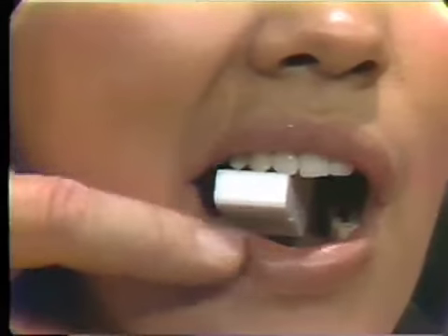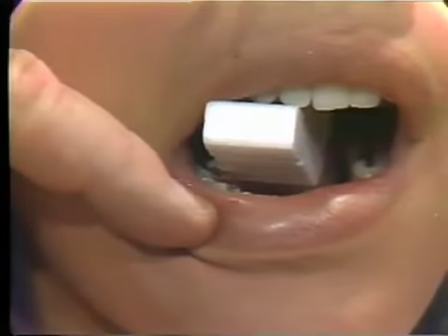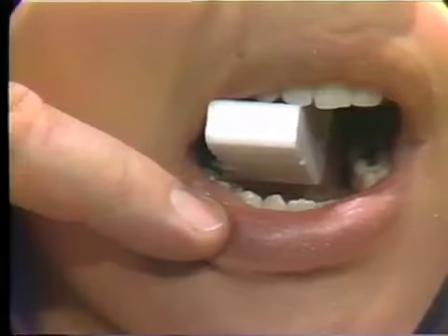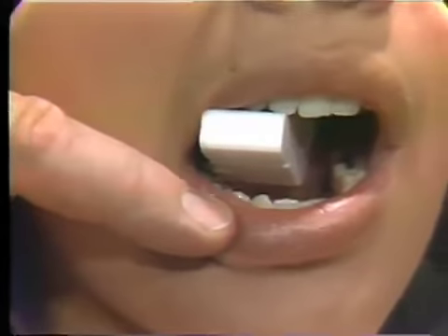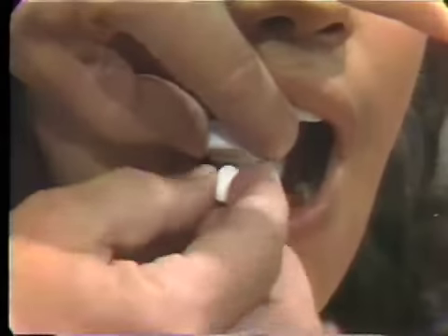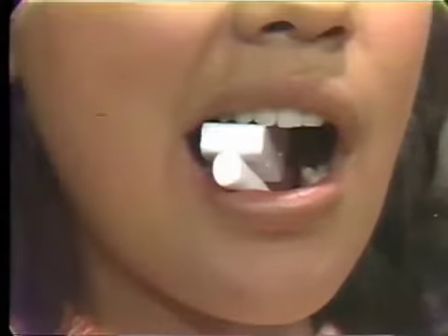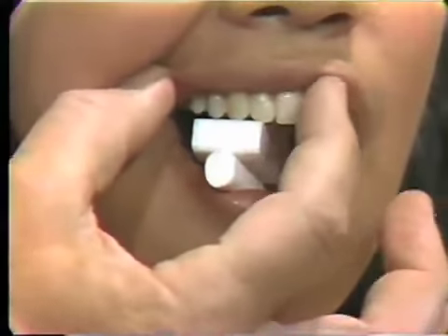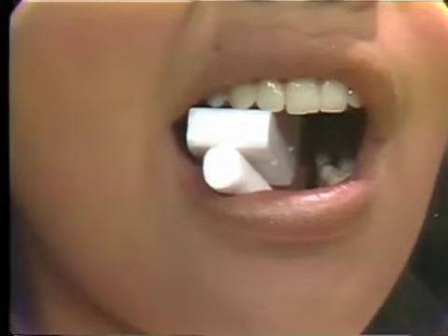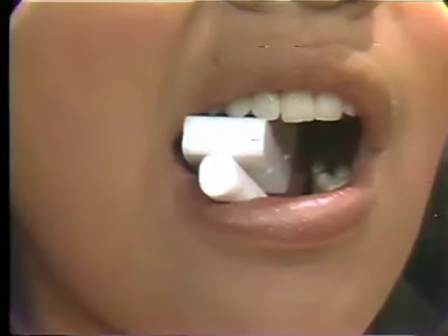Now we notice that there is only one cusp that is doing any holding on the bite block. This is a little precarious, and so I want to fill in the wide open spaces beneath the block with a cotton roll. So open, please. Now I insert the roll. Now close again. Now the film is positioned securely. Steps number 2, 3, 4, and 5 would be the same as has been illustrated with the centrals.